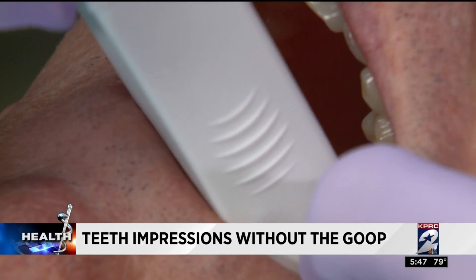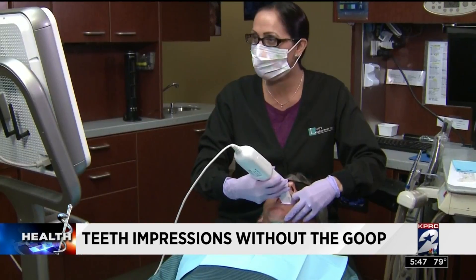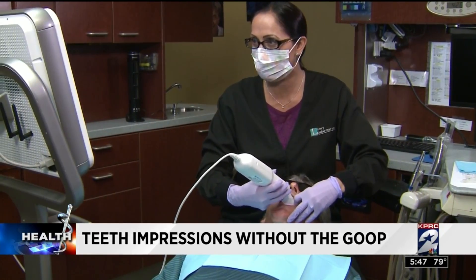Well, the goop is gone at some dentist's offices. The scanner just makes things so much better for our patients as far as accuracy, as far as being able to visualize things. Dr. Larry Lieberman is talking about the iTero scanner.